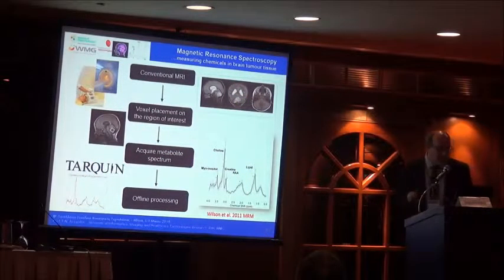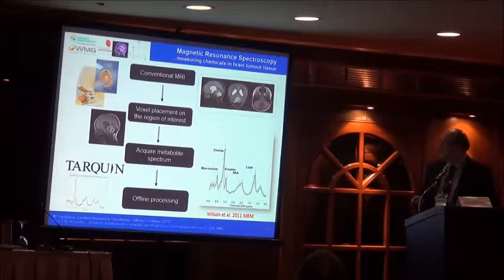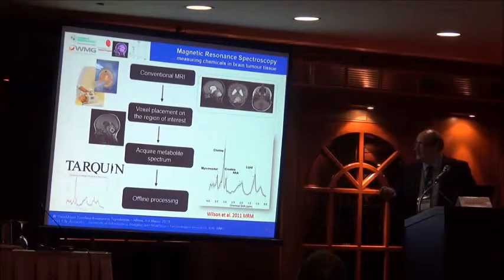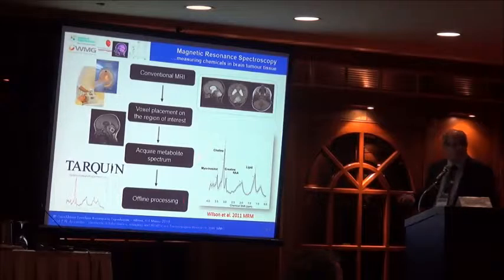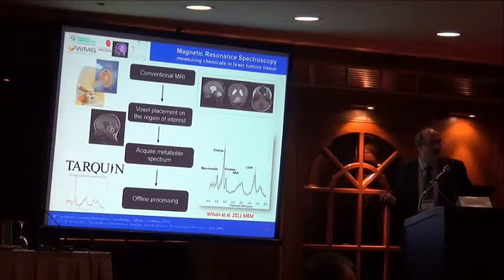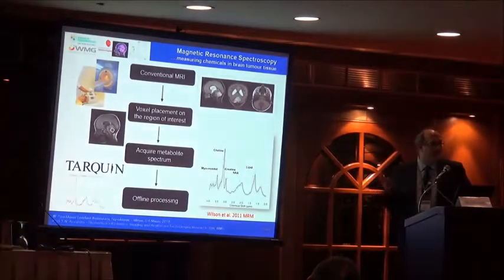So let's talk a little bit about these functional imaging techniques before I come to the point of how texture can be combined with these. In addition to the conventional MRI in the clinic, by using the same scanners, the same coils, now we can, on the basis of an image, place a voxel in the anatomy where the tumor is, and then in that region of interest, we can acquire a metabolic spectrum. It's like we do biochemistry. And NMR has preceded the clinical work, so it's like we bring the old chemical NMR into the clinic.